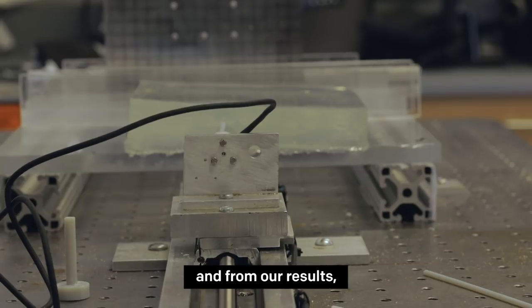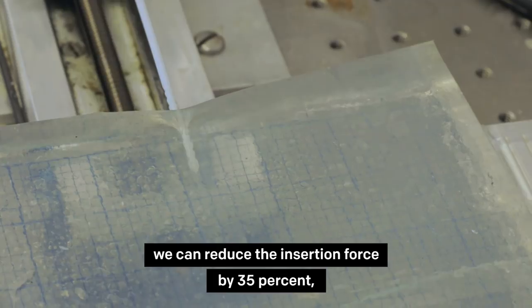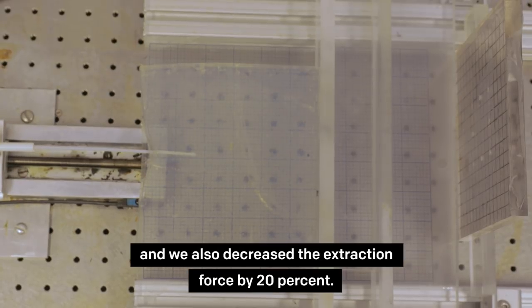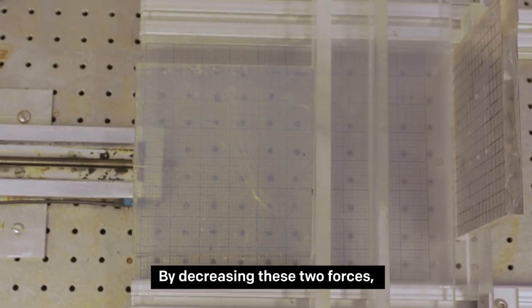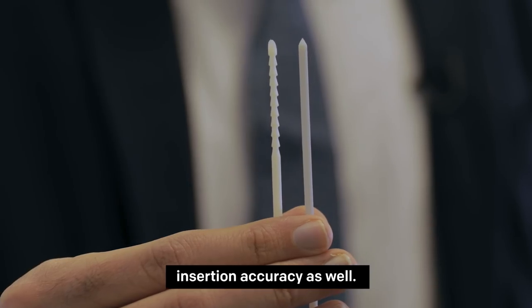From the results, we can say that we reduced the insertion force by 35%, and we also decreased the extraction force by 20%. By decreasing these two forces, we hope to increase the insertion accuracy as well.